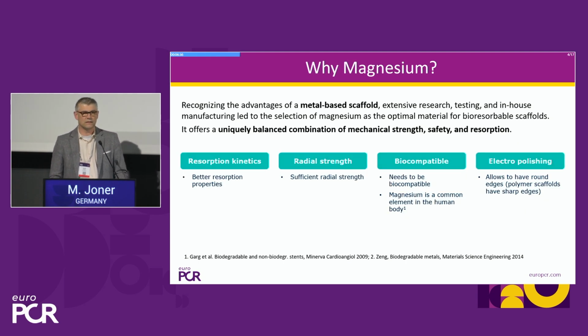So why would you work with magnesium? We've heard, a decade ago, the rise of polymeric bioresorbable scaffolds. Unfortunately, it came down because of a risk, again, in late thrombotic events, and the issue was supposed to be the late scaffold dismantling. So you have to control that. You have to be much quicker in terms of resorption. And this is what is so excellent with magnesium.